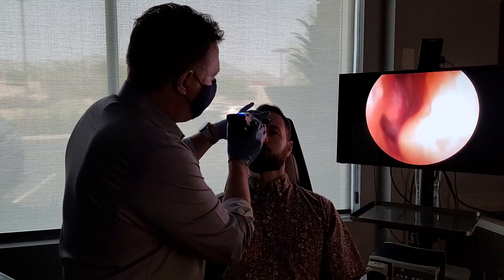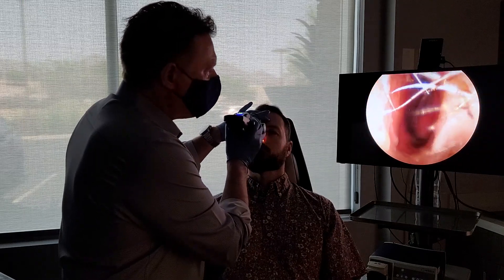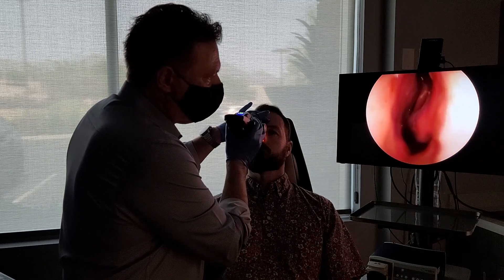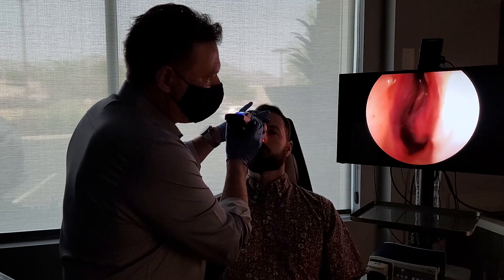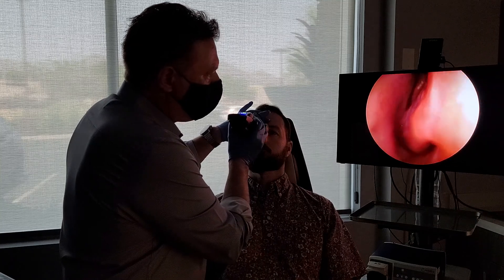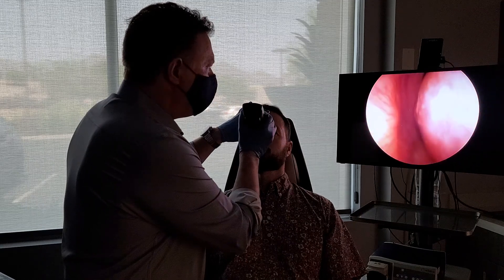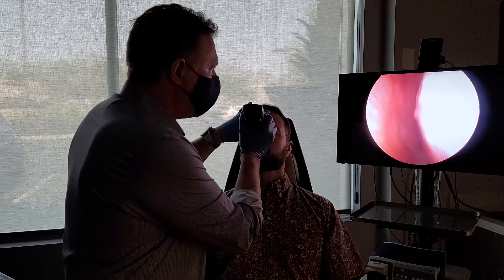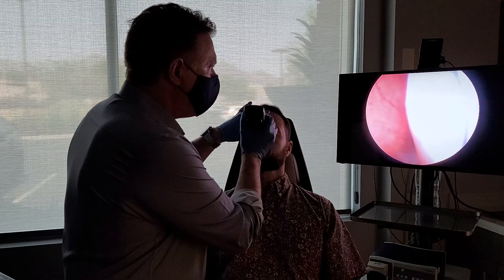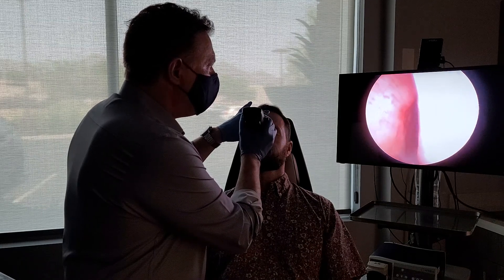Now I'm gonna remove and go back into the opposite side. If I have to determine which side is gonna give me the best view to look in the back of Kevin's nasal cavity, I'm gonna choose a side that has less blockage so the septum is out of the way. I can come inside the nasal cavity and come along the floor between the septum and the inferior turbinate. As I slowly move back farther, I'm gonna be able to see the nasal pharynx.